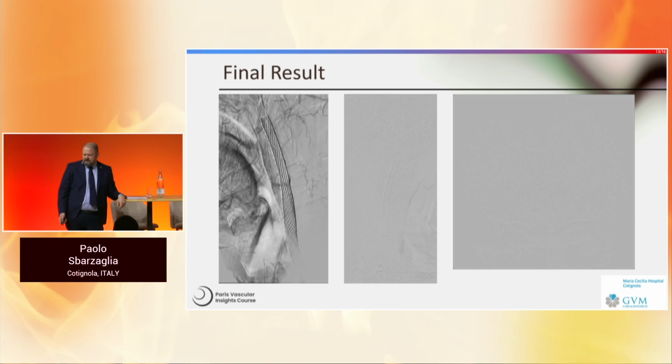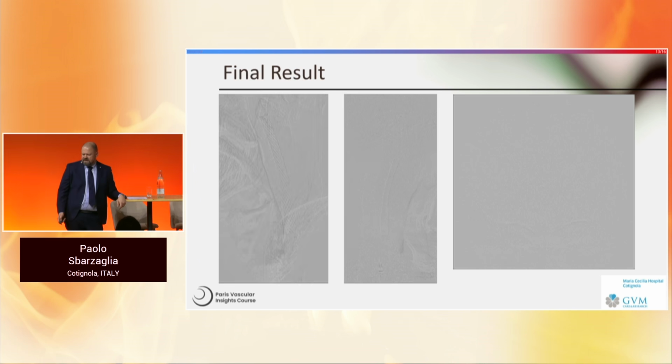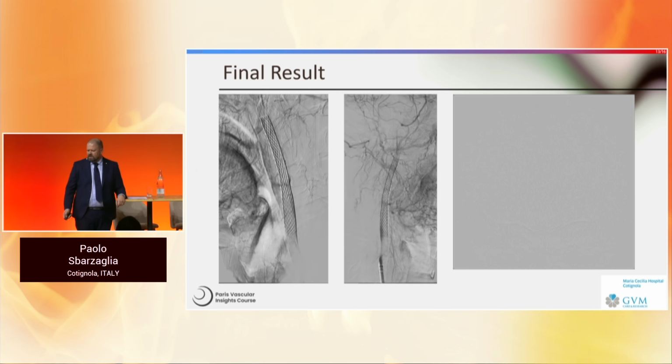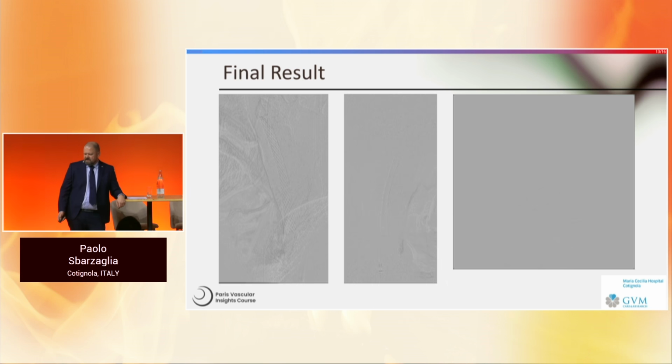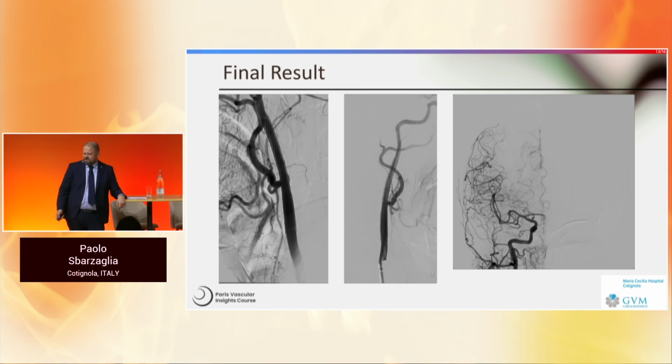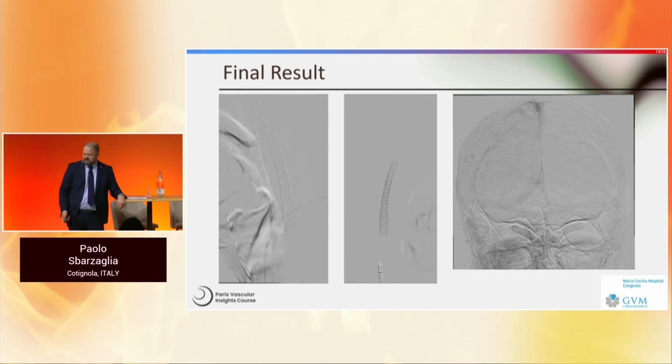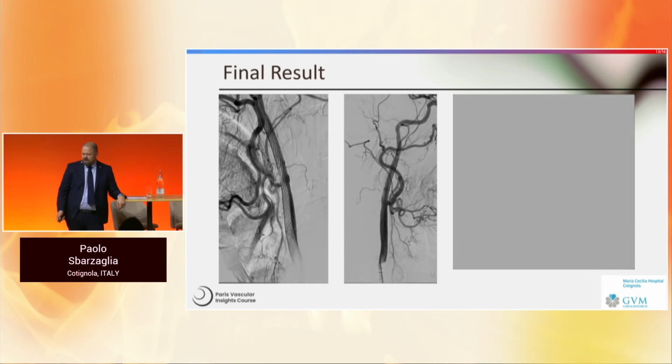And this was the final result, which was a good result, and we had a very nice catch-up also in the flow, a good increase in the intracranial flow, and also a catch-up in the anterior cerebral artery.